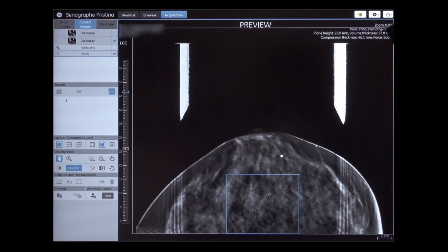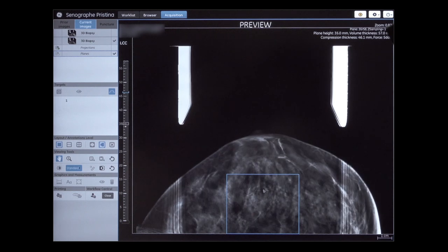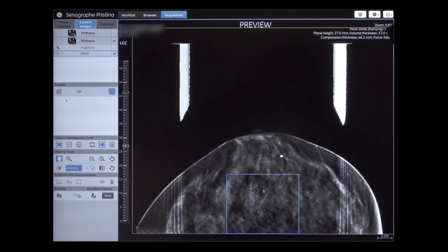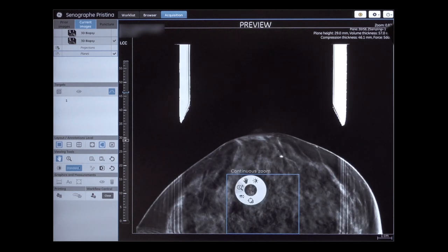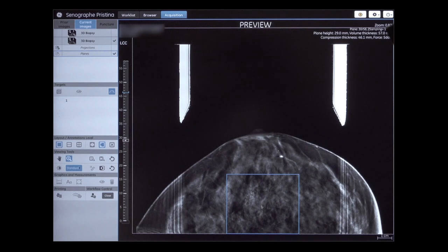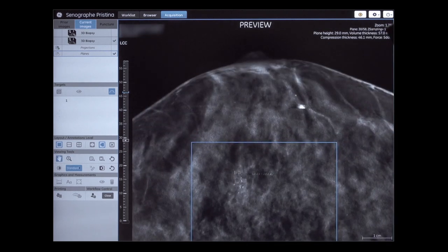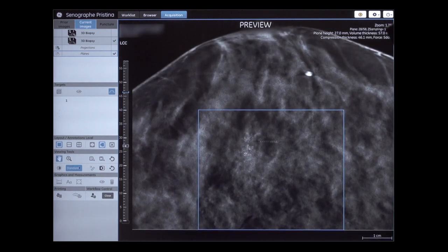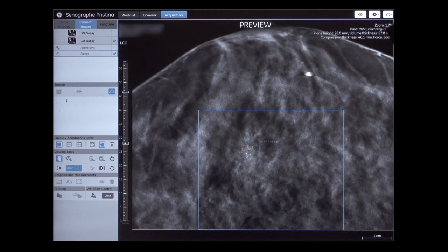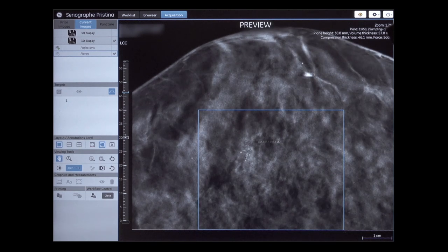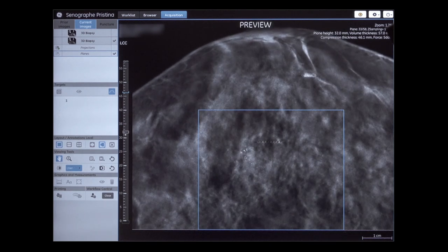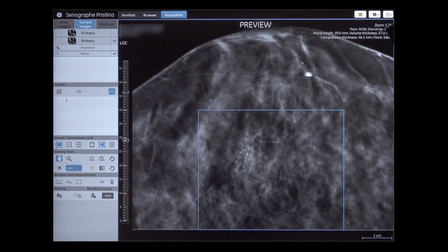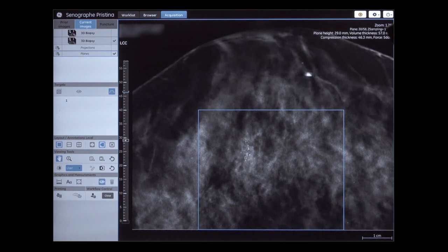Scroll through the Tomo images to select the plane showing the target. Zoom the image for better visualization and target selection. Note that the Preview Reconstruction is now replaced by the final reconstruction.